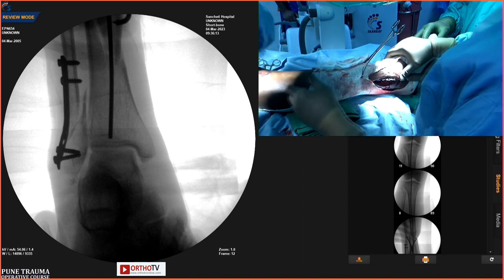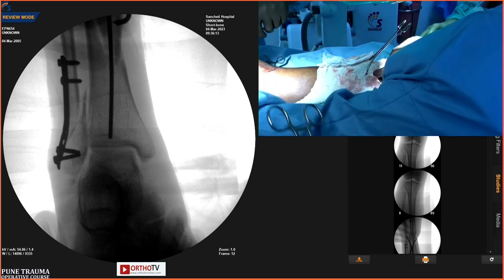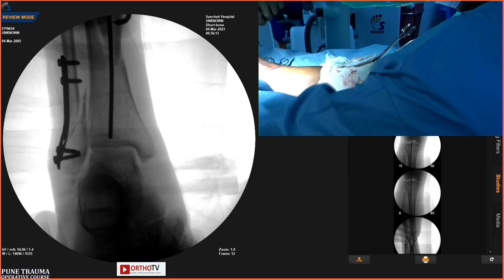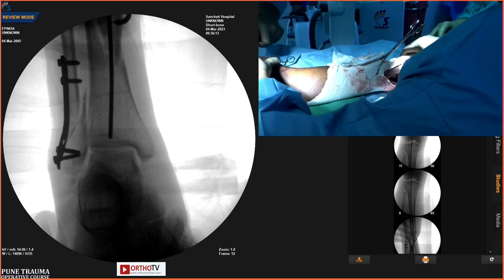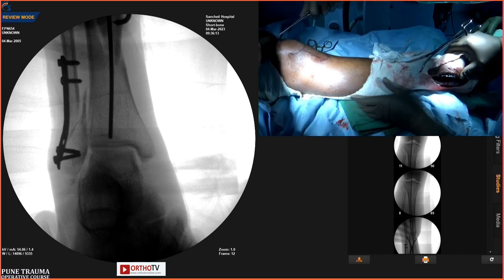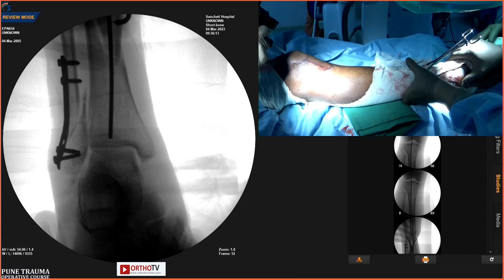This looks center. Comminution. There is no question of dynamization. I'm just saying, too comminuted a fracture. Generally speaking, how far do we go down? Up to the guide wire, if you have gone, it has already gone subchondral. The nail cannot go down even if you dynamize. Correct. So in a mid shaft, if you're doing it, put it short of the lower end, so that if you want to dynamize on day one, you can dynamize. But into the lower one third is not practical.